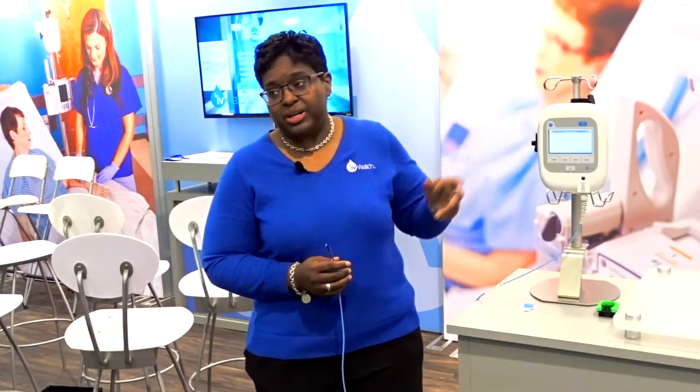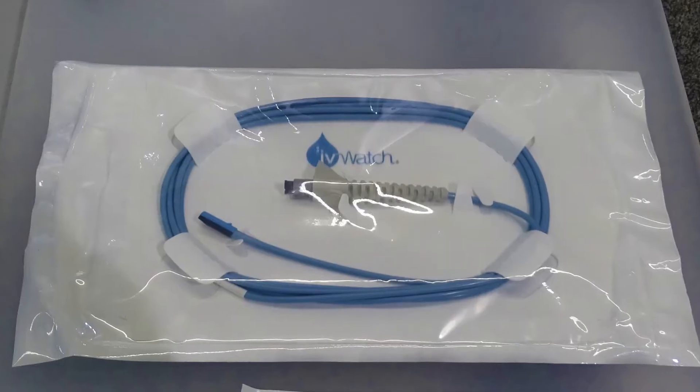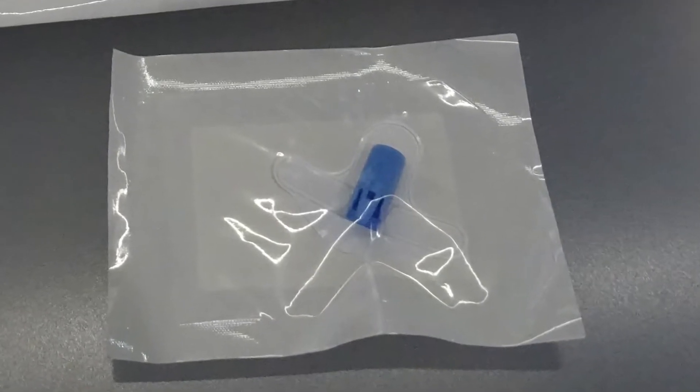Looking at the system, there are three components. You've got the monitor itself, which is a standalone unit that clamps right onto the IV pole. Then you've got the reusable sensor cable, which is good for 240 hours of monitoring time. And then you have the single patient use sensor receptacle.